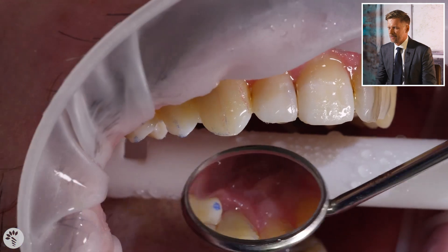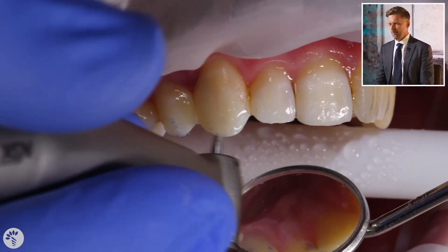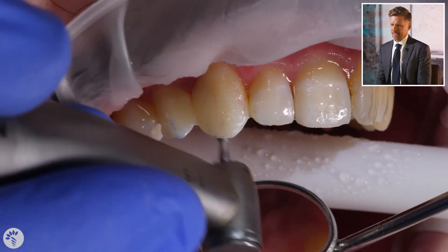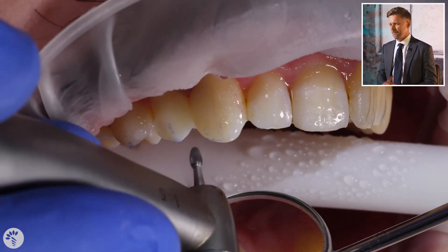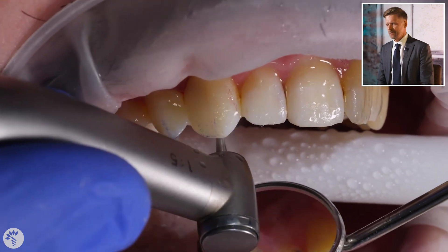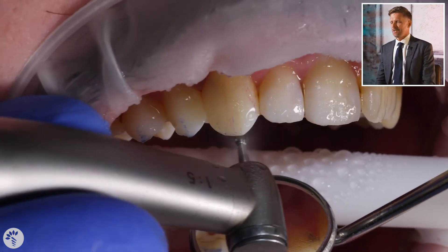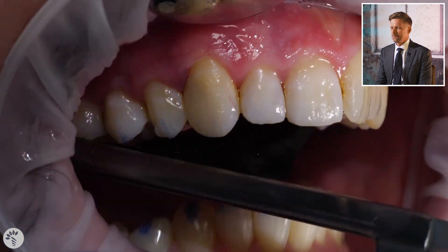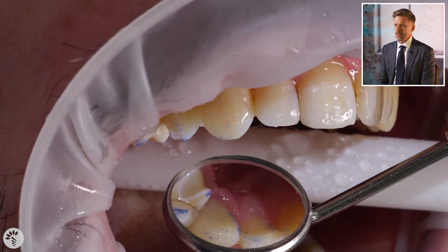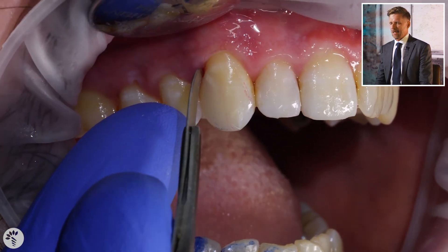There's no point going on until the occlusion is perfect. You don't want light occlusion with carbon paper on the resin — you want no occlusion on the resin and all the occlusion on the tooth. It will shift over time but you want it to start that way. People give up because they're tired of adjusting and want to go home, but then the patient calls the next day when you're fully booked. If it's taking too long, get a new bur — finishing burs get blunt and slow you down.